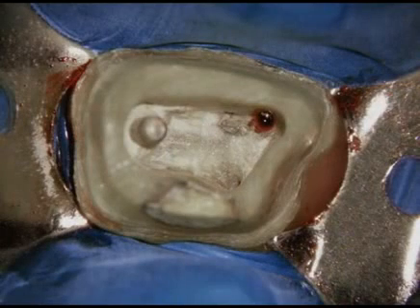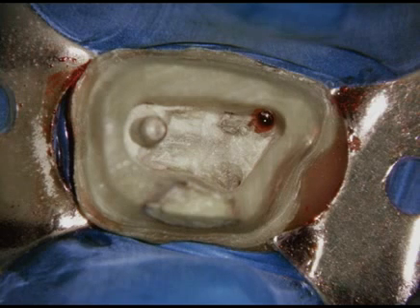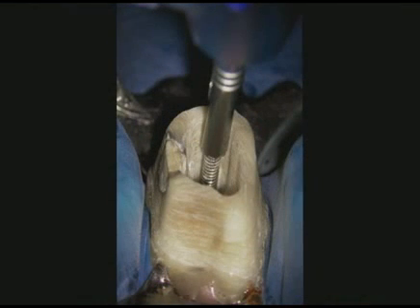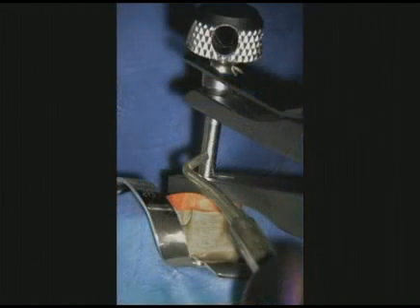Here we can visualize straight line access to the fully exposed post, bleeding from the MB1 orifice, and evidence of an MB2 orifice system. In this case, I utilized the post removal system. A selected trephine precisely machines the coronal 2 to 3 millimeters of the post. The head of the post is perfectly round and can be tapped. This photograph shows the extracting plier mounted onto the engaged tap, the compressed rubber cushion protecting the tooth from the removal forces, and a previous version of the Endo 1 vibrating the engaged tap.